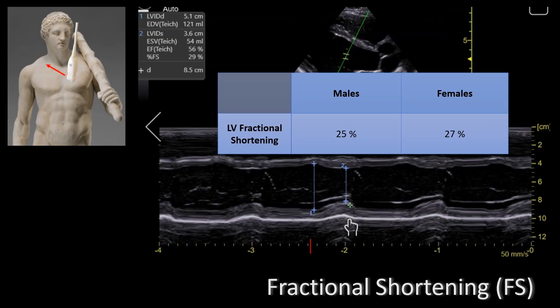Let's go back to our patient and see the numbers that we got. The left ventricular internal diameter at diastole was found to be 5.1 centimeters. The left ventricular internal diameter at the end of systole is 3.6 centimeters. By using the equation shown earlier you can calculate the fractional shortening. This ultrasound machine actually calculates it on its own and found it to be 29 percent.